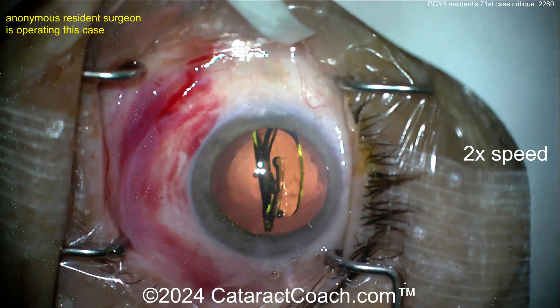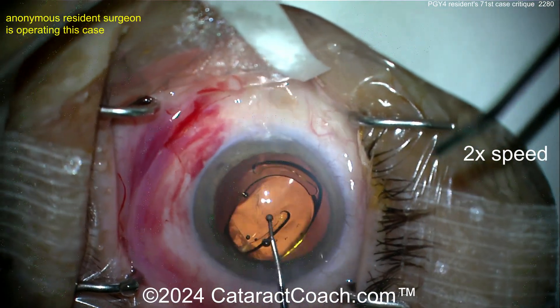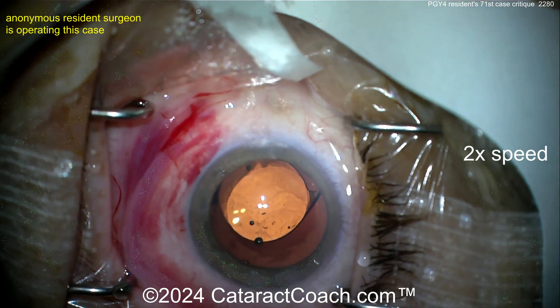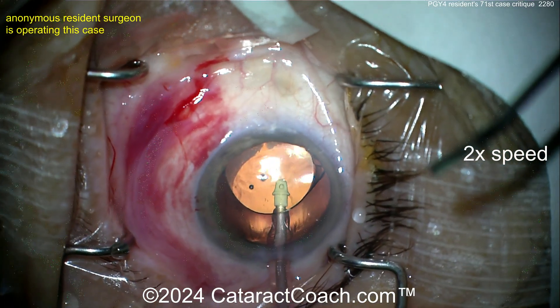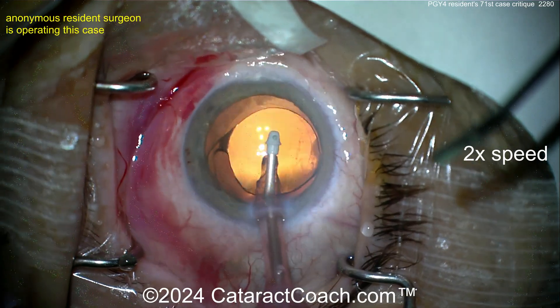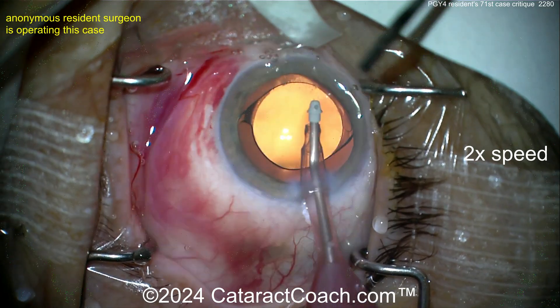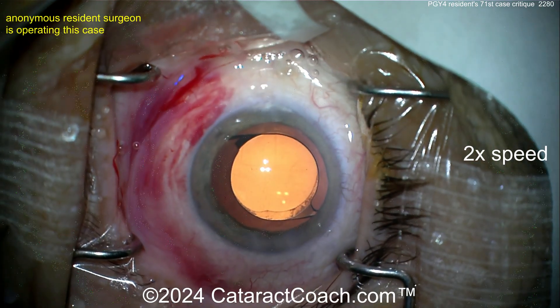Here comes the lens going into the capsular bag. Polishing the anterior capsule isn't entirely required at this stage — save the finesse for later as you improve. Get that haptic opened up, lens centered. Going behind the optic to remove viscoelastic — that's important. When you start using toric IOLs you'll really need to remove all the viscoelastic. You'll also need a bit more overlap of the optic by the capsulorhexis.